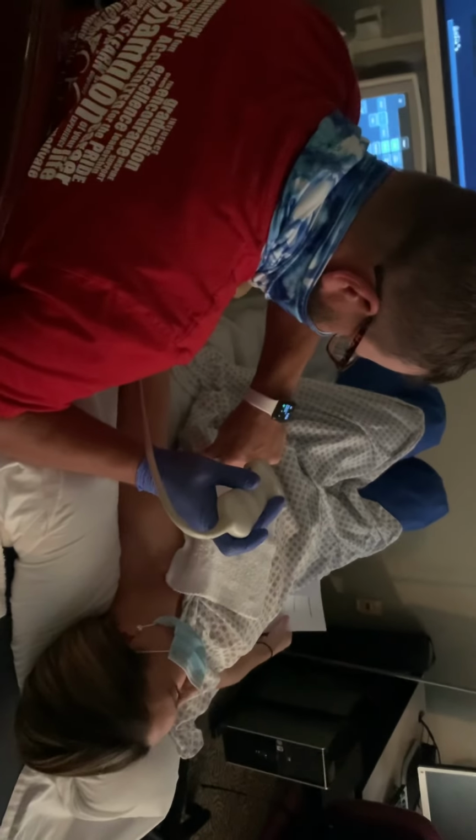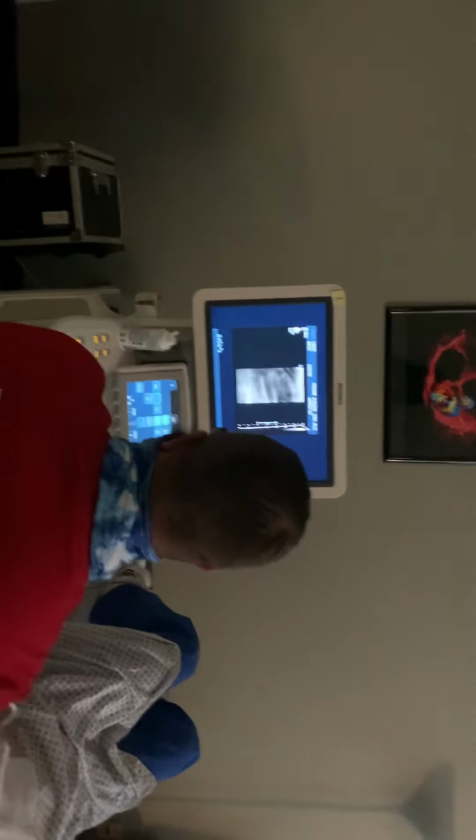And now, she's not going like this. We're going to do it like this. Hold on, let me just get it out. Okay. Fine, thank you. So I'm going to come over here and I can actually follow.